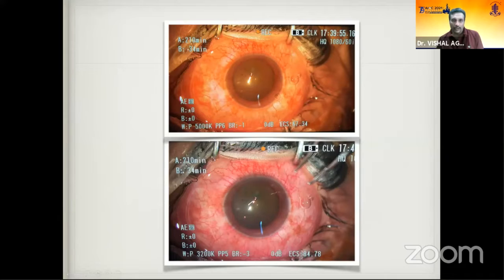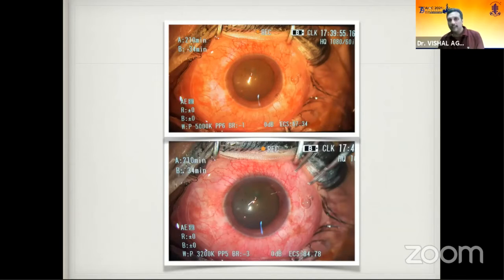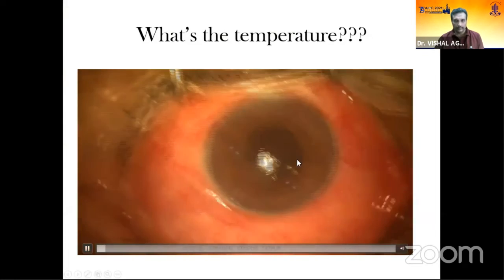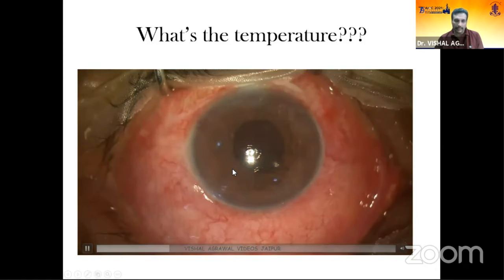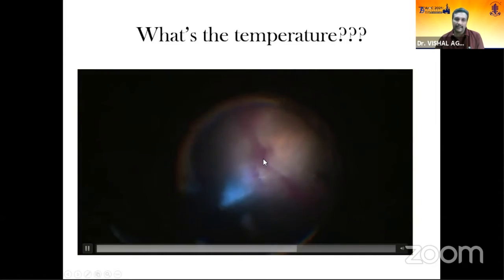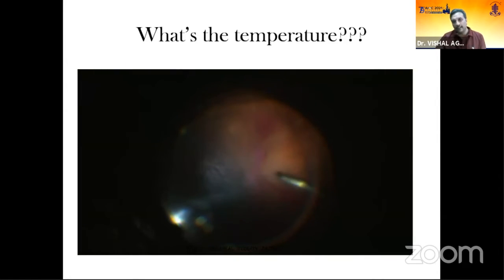An important setting is the Kelvin temperature. For anterior segment work you need the temperature to be lower because the microscope light is bright enough. When you go to a VR surgery or posterior segment maneuver you have to increase it since you're working in a low-light environment. At 5000K the image appears more unnatural, while 3200K gives a more natural photograph. For anterior segment work the range is around 3000 to 3500K. For posterior segment work you increase to 5000 to 5100K to achieve a more natural appearance.